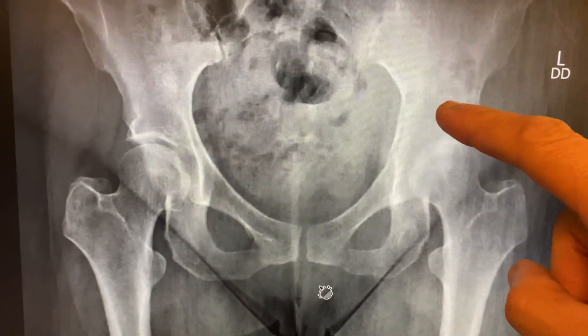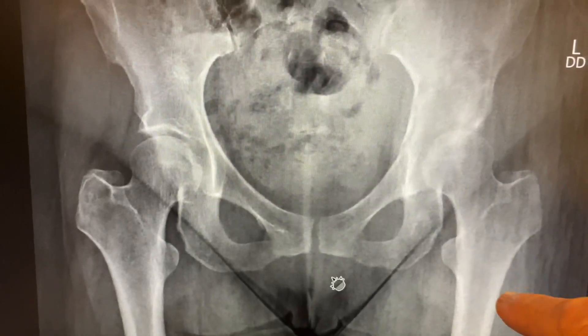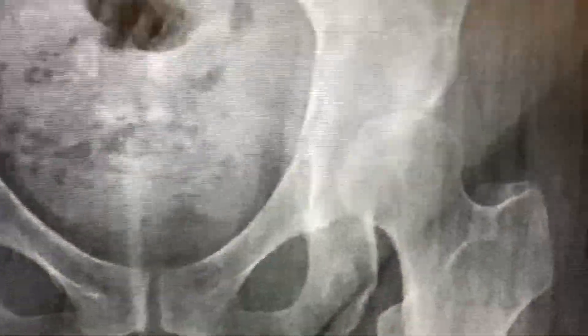Destructive, involving the femur and acetabulum and the ilium. Femoral head — do you see the difference? Ball socket. Right here, you don't really see the ball socket very well — it's obliterated. The lesion goes all the way to here.